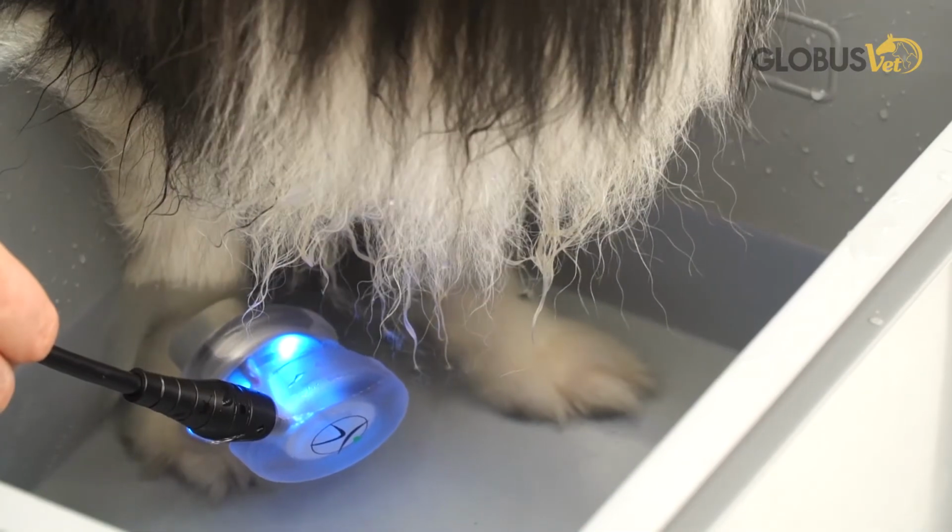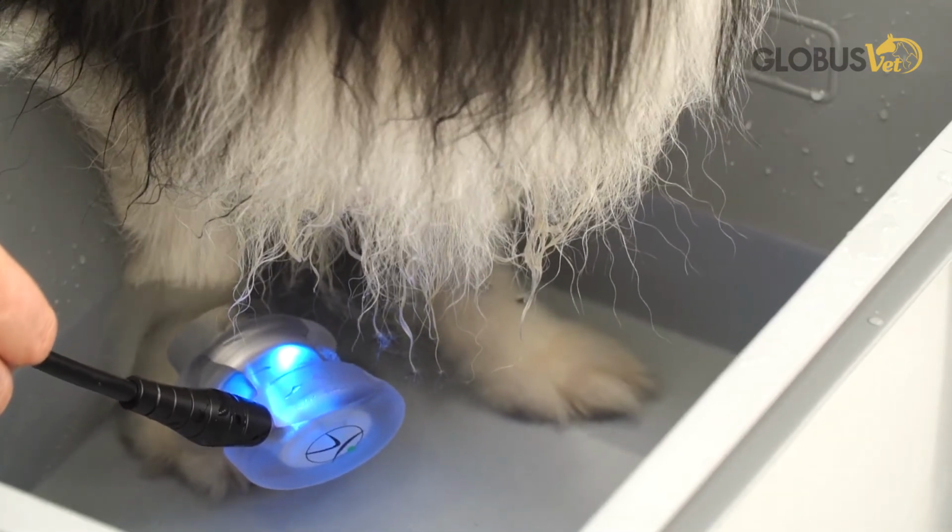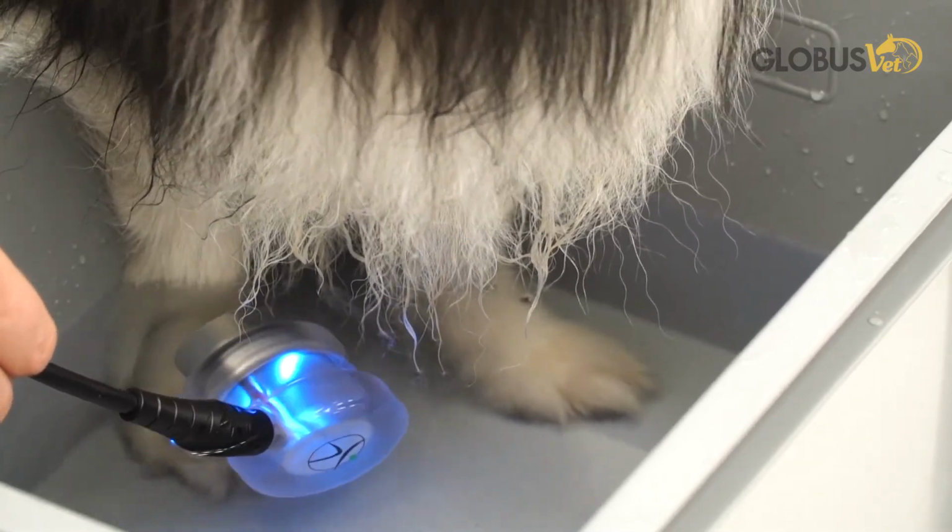Another way of using ultrasound therapy is the submersion underwater method. If the treated area is uneven or hard to reach, or even too painful to be touched, you can use the underwater method. It is very useful for conditions affecting the extremities, such as phalanges or carpal bones.